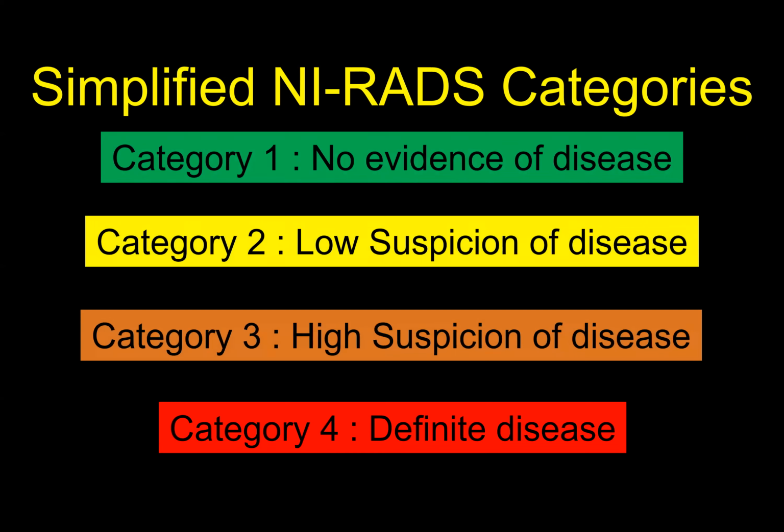Now, this totally makes sense to me, and that's how my entire job over the past 20 or 25 years has been with studies. I think this is normal. I see something, but I'm not very suspicious. I see something and I am suspicious, or this is definitely disease. This guy's got an SCC. There's something going on in that case. That's how I think about things all the time.